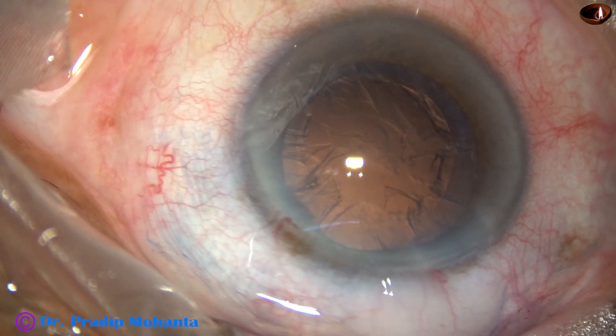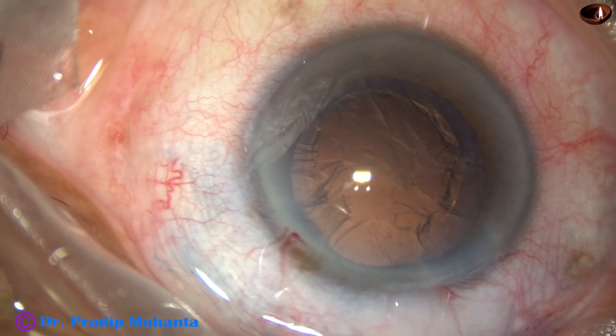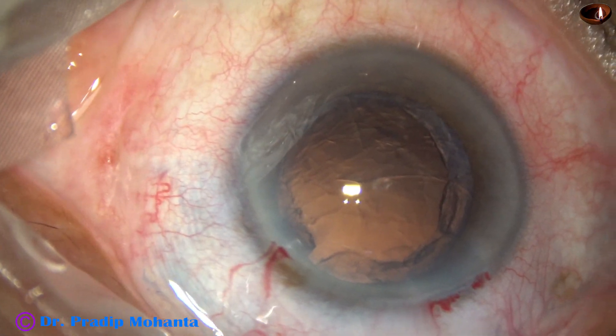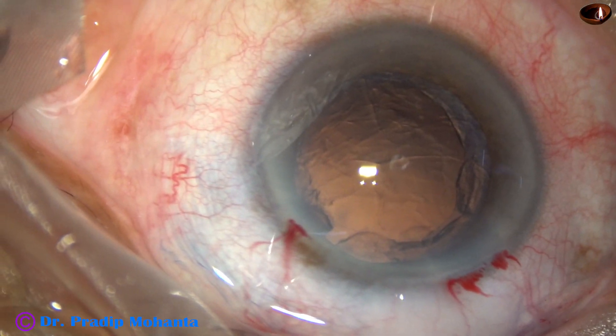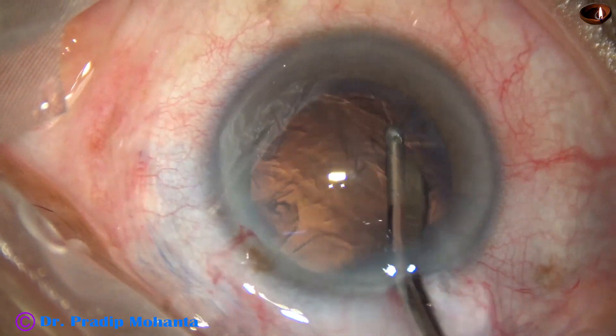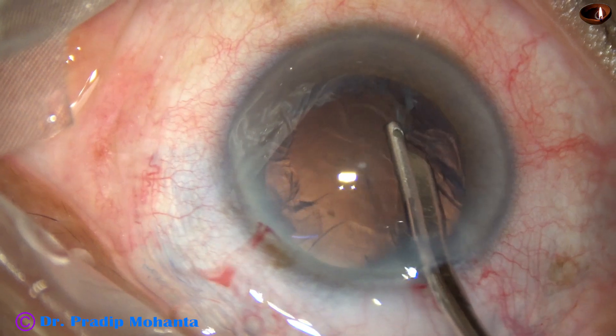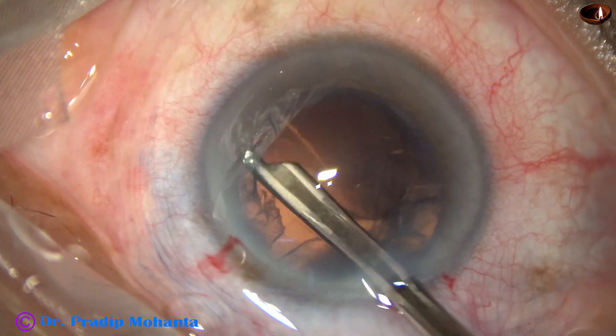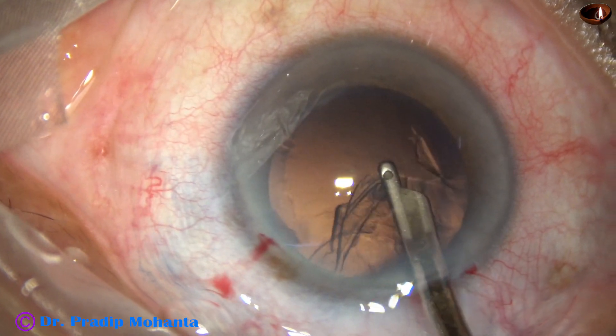The nucleus and epinucleus have been nicely managed. Some viscoelastic has been injected into the anterior chamber and a 23-gauge Simcoe cannula is used to remove the cortex — most of the cortex except the sub-incisional cortex.